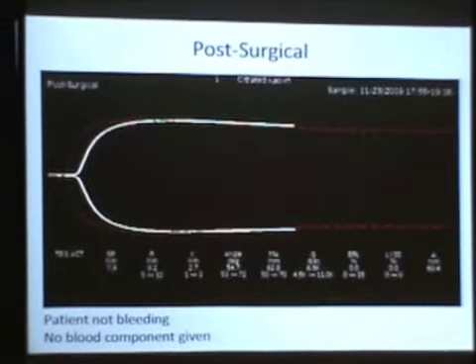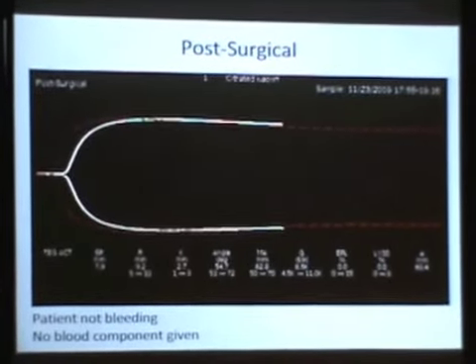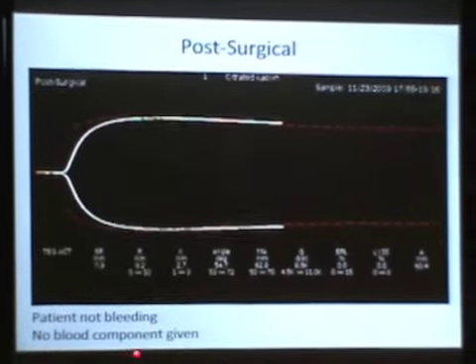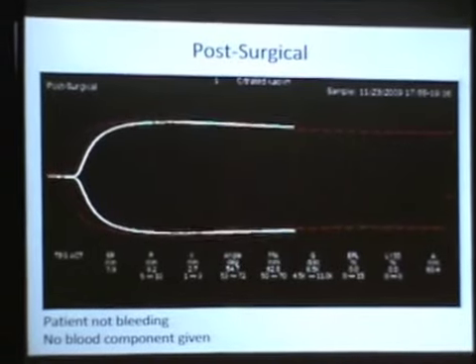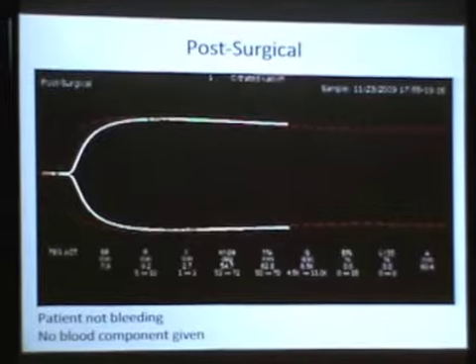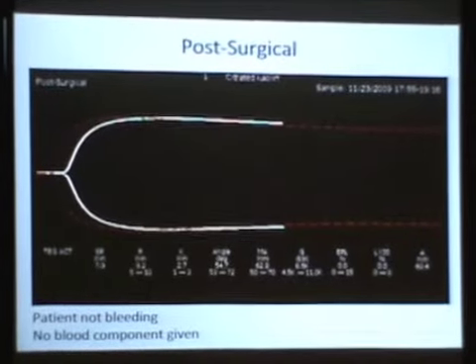So you mean this is basic hypercoagulation? Yes. His baseline. And the Plavix was working with him well. Why don't we put him on Plavix? Because we knew that by lengthening this R time, this MA narrowed. So now we know it's thrombin that's causing the hypercoagulability. Okay, not the Plavix. Right. Not the platelets.